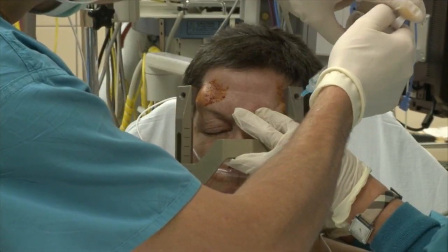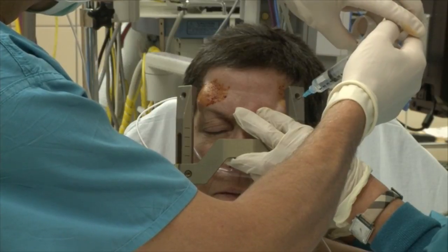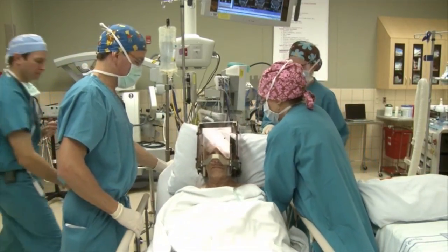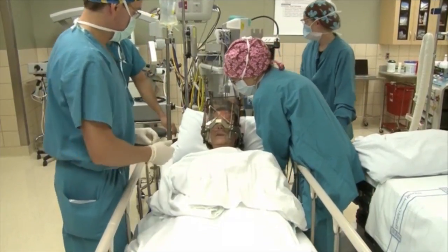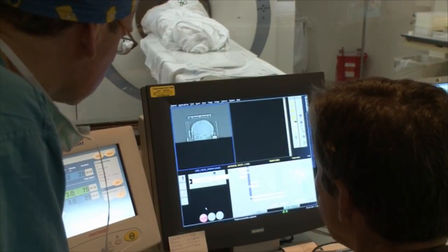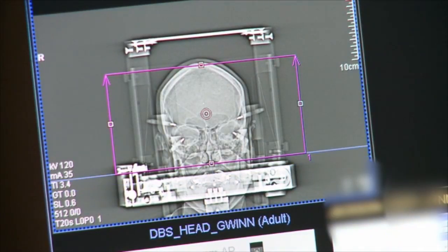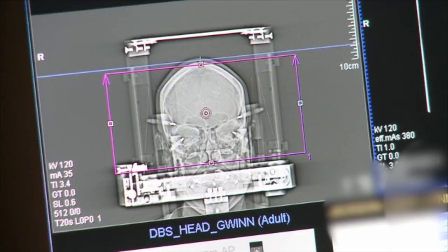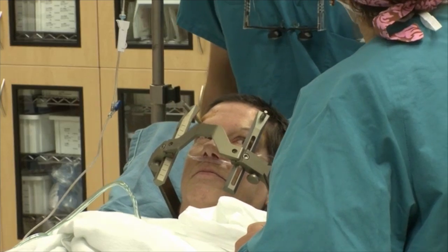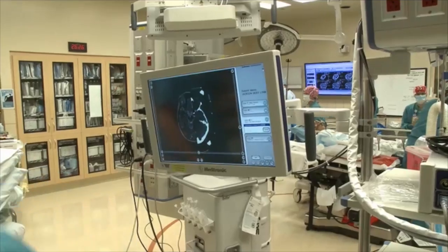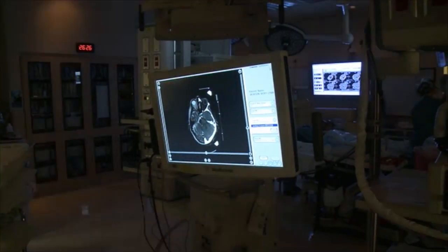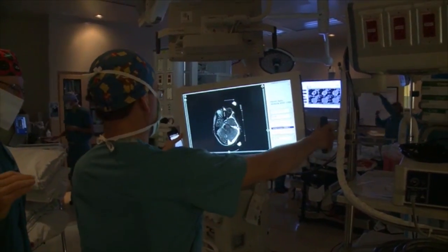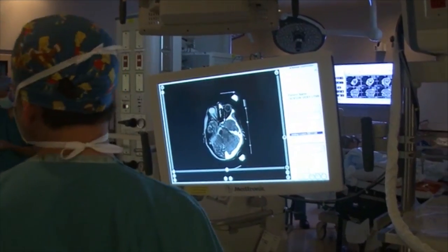Once this numbing medication is in, we put in the pins that hold this frame. We're putting on a box that enables us to use the CT scan to know exactly where we are — this is what we call a scout image, looking at her skull and making sure we'll acquire the right images through the region of interest used for targeting. This process is fairly complex with a huge team involved: nurses, anesthesiologists, our neurologist Jenny Witt, radiologists, and technicians. It's very specialized — not every center has the equipment and resources to really get this done right.